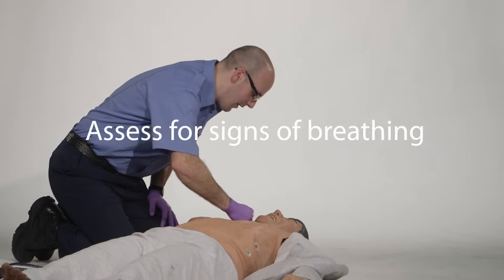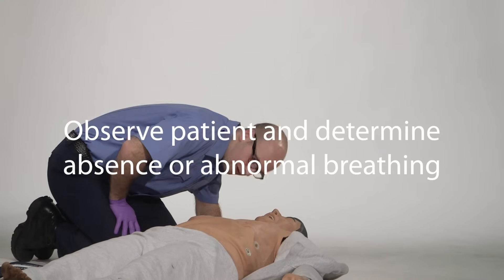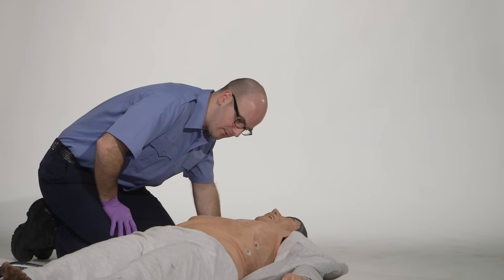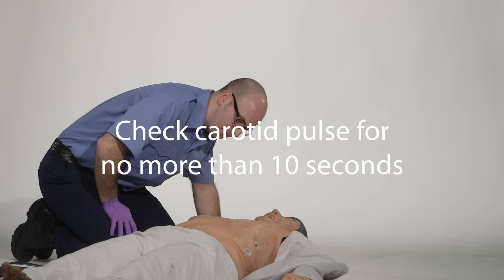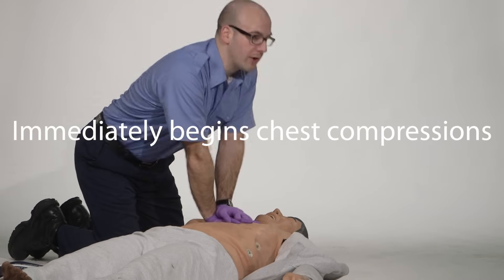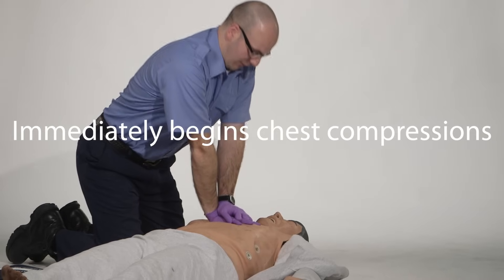Assess patient for signs of breathing. Observe the patient and determine the absence of breathing or abnormal breathing — for example, gasping or agonal respirations. Check a carotid pulse for no more than 10 seconds and immediately begin chest compressions with adequate depth and rate, allowing the chest to recoil completely.